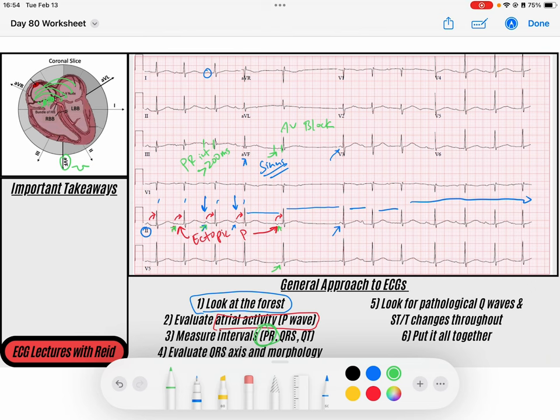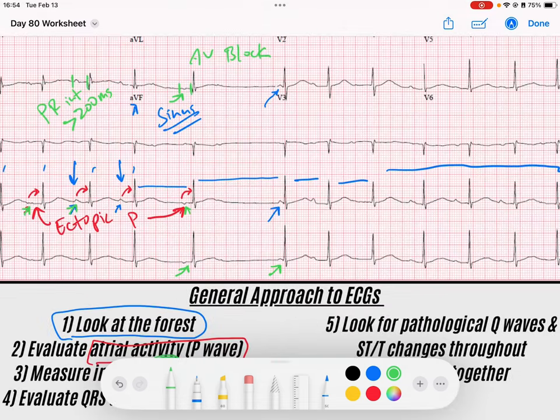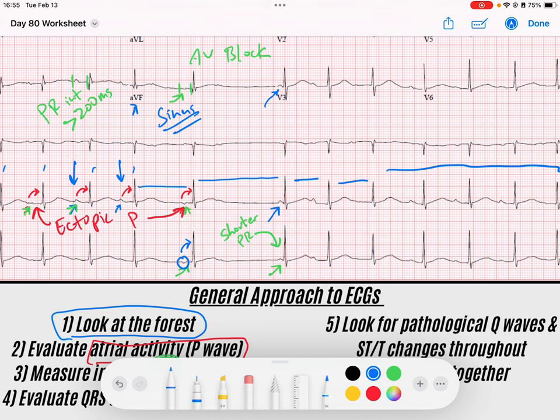Generally the PR intervals stay somewhat consistent. There's a PR interval here, and then this one is a shorter PR interval. Looking at what happened before: we've got a P wave that conducts to a QRS, then an ectopic P wave that conducts to a QRS, and then it looks like there's a bit of a pause. If you look closely at the end of the T wave you can see a little deflection that doesn't occur in the previous beats.